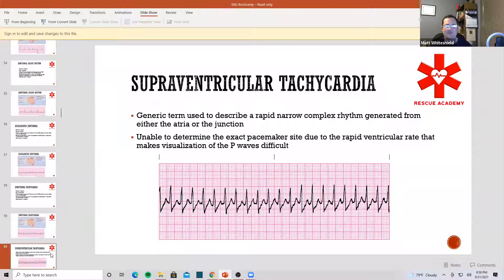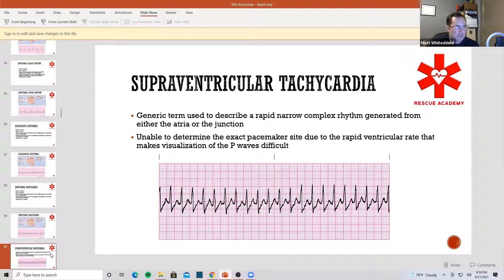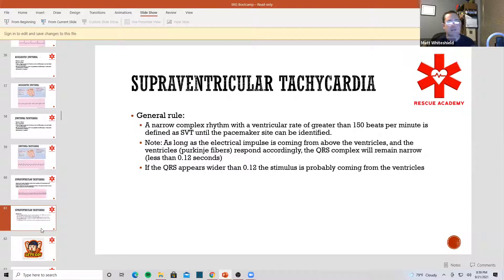SVT — why is SVT brought up here in junctional? Let's say we have a rhythm that is greater than 150, a really fast rhythm, and I can't tell if I have a P-wave or not — is it a junctional rhythm or is it an atrial rhythm? Well, if I can't tell, we call it supraventricular tachycardia. As a general rule, a narrow complex rhythm with a ventricular rate greater than 150 is defined as SVT until the pacemaker site is identified. Then we could call it atrial tachycardia or junctional tach — but because we don't know, we call it SVT.